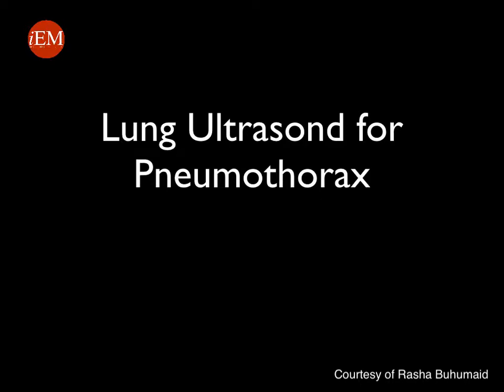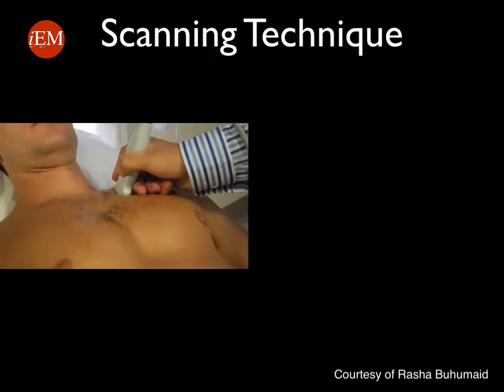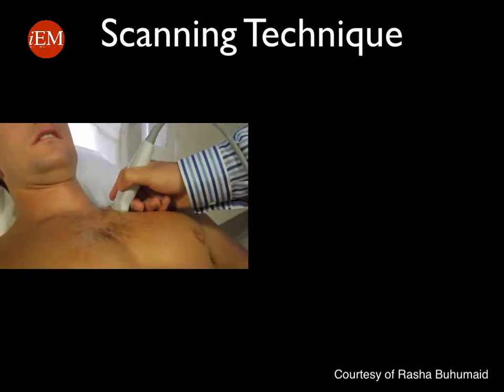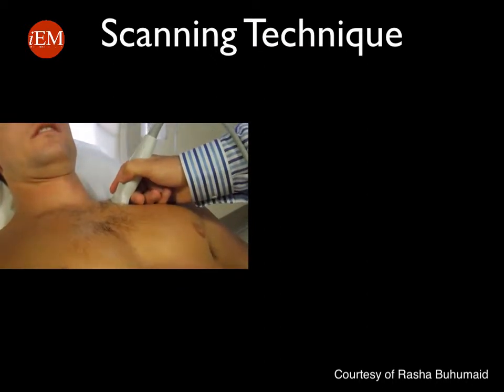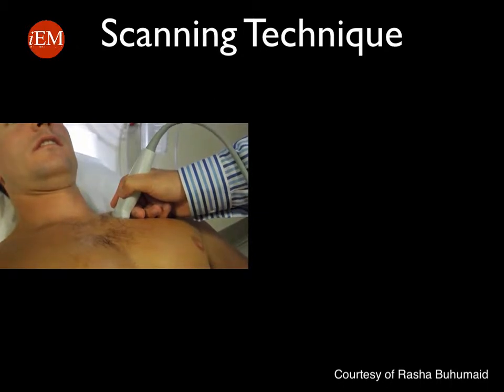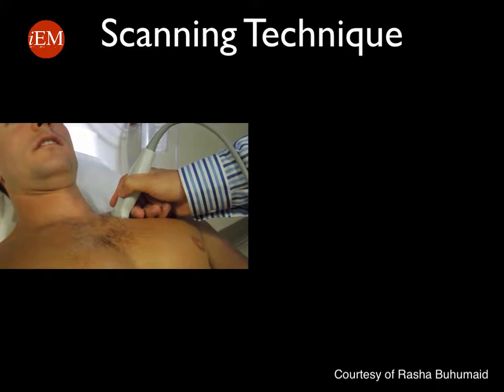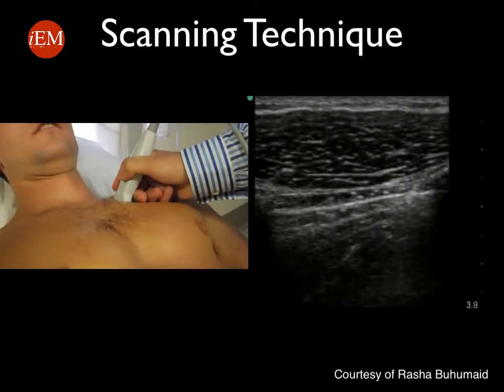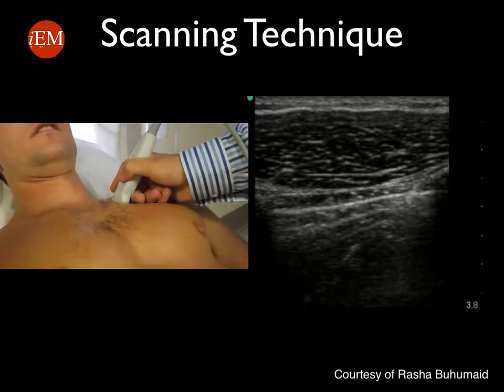In this tutorial, we will discuss how to perform lung ultrasound for pneumothorax. This study is obtained using the linear or vascular probe, or a high-frequency probe. You will place the probe on the anterior chest wall at the mid-clavicular line, probe marker towards the patient's head. You can start between the second and third intercostal space in a supine patient.